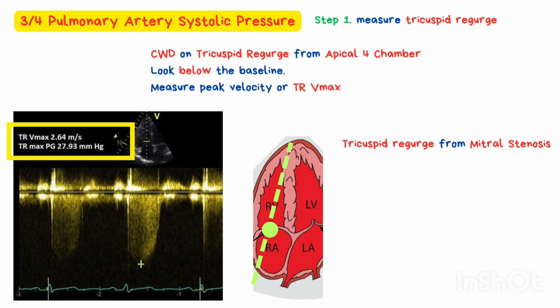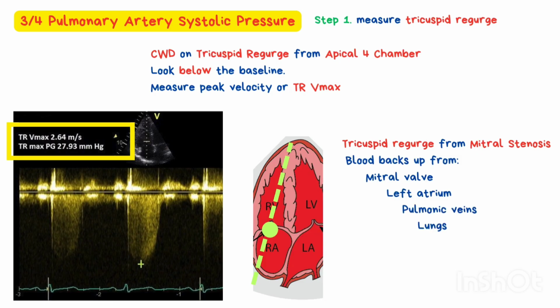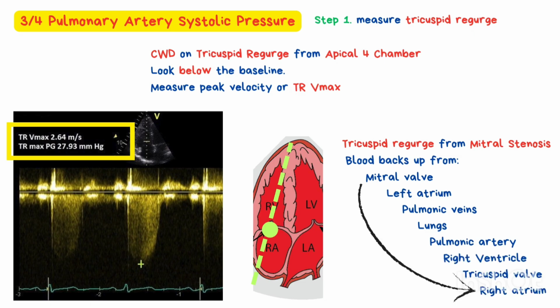When mitral stenosis becomes significant, blood backs up into the left atrium and eventually into the pulmonary circulation. Over time, this leads to increased pressure in the pulmonary arteries, which can then strain the right side of the heart, leading to a consequence of mitral stenosis, tricuspid regurgitation.